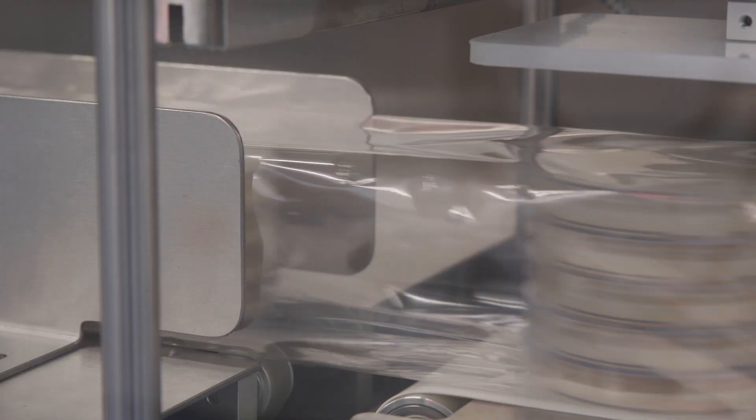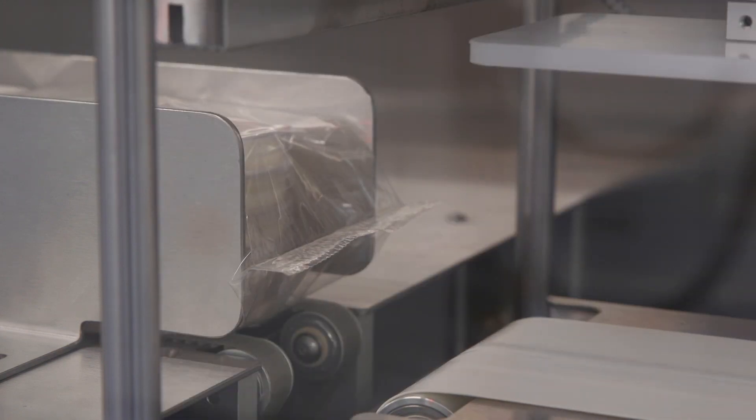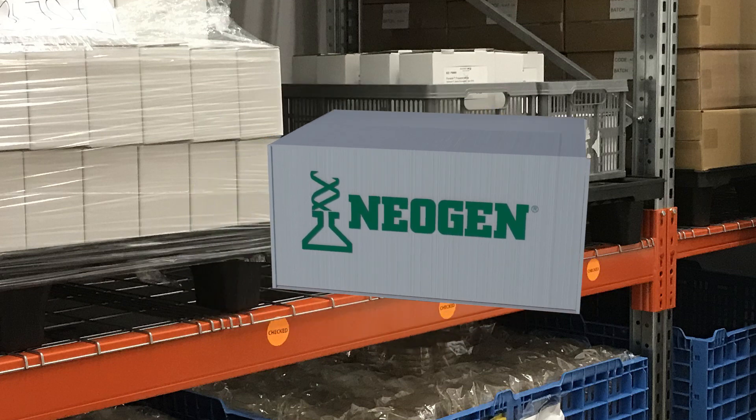The plates are stacked and moved along for packaging. Film wrapping is used to minimise moisture loss and optimise the life of the product. Plates are then boxed and stored in our large refrigerator before they are ready to be shipped.